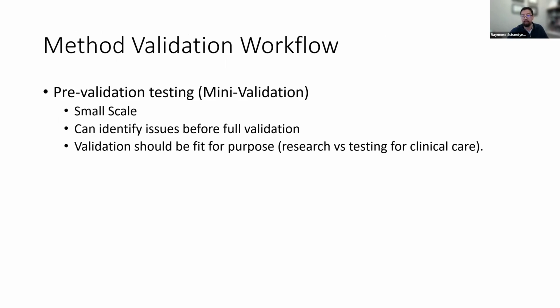Research versus testing for clinical care would be an example. And you want to do this because, if you're working with a lab, an experienced lab will always do this. Doing a full validation and finding out there's all sorts of problems, after you've invested months and months of time, means you just have to start all over again. So we don't like to do that.